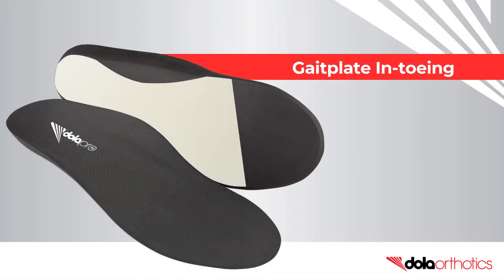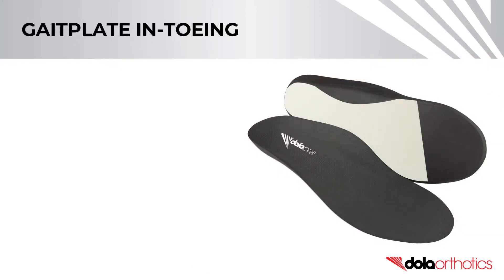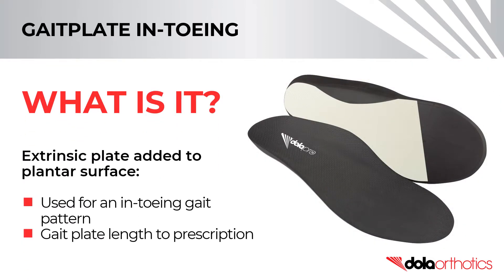How to modify a full-length Dollar Pro orthotic with an in-toeing gait plate. An in-toeing gait plate can be used to address an in-toeing gait pattern.